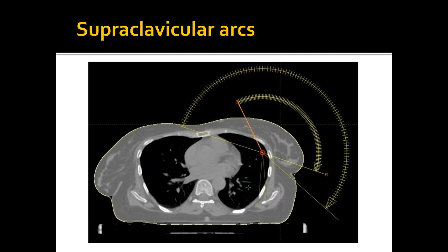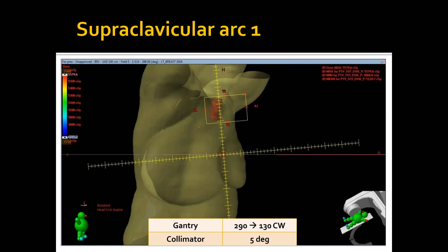For the supraclav, I used two partial arcs as well. This is the first arc extends from 290 to 130 clockwise with a little bit of a collimator angle. And this is just to give the optimizer some flexibility at the edges of the target. And this is the second arc from 119 to 330.